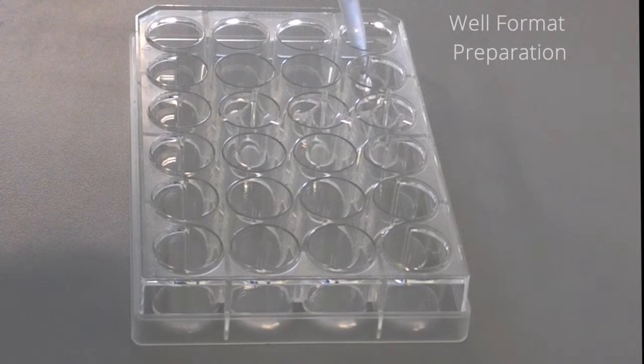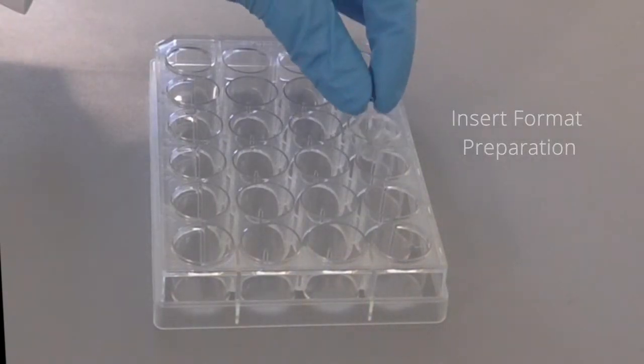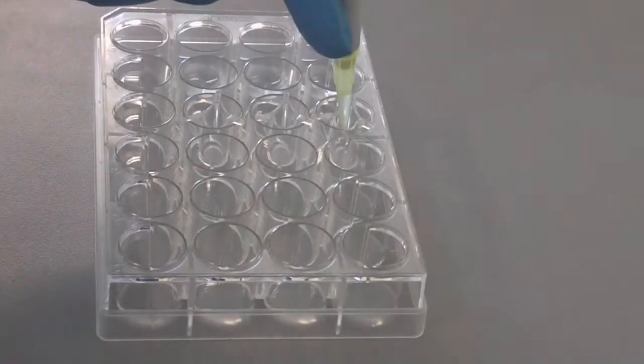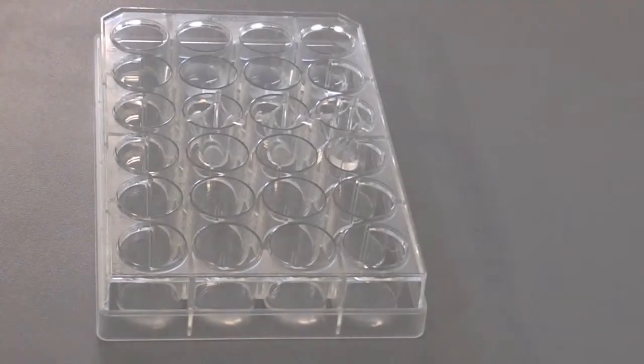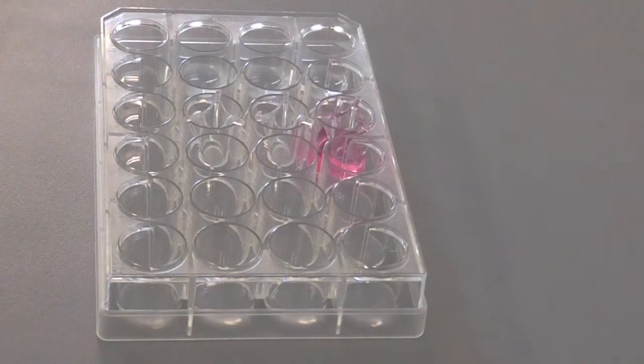For the well plate method, pipette the pre-gel solution into the bottom of the well plate. For the insert method, gently pipette the pre-gel solution into each well plate insert. Add cell media into each well outside of the insert so that the pre-gel solution in each insert is in contact through the membrane with media from underneath.